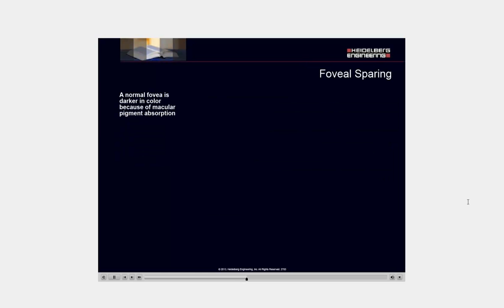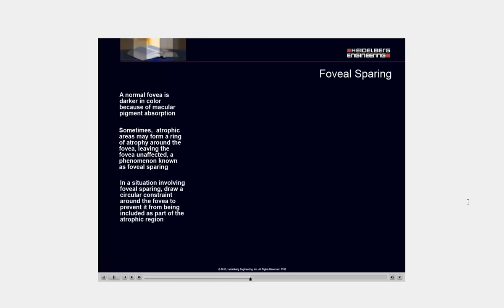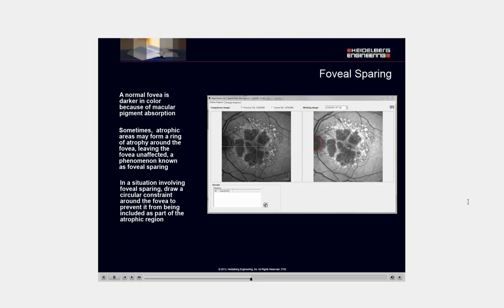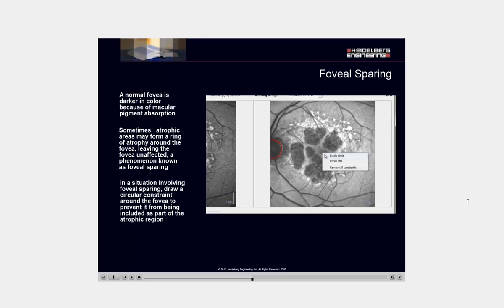A normal fovea is darker in color because of macular pigment absorption. Sometimes atrophic areas may form a ring of atrophy around the fovea, leaving the fovea unaffected, a phenomenon known as foveal sparing. In a situation involving foveal sparing, draw a circular constraint around the fovea to prevent it from being included as part of the atrophic region.